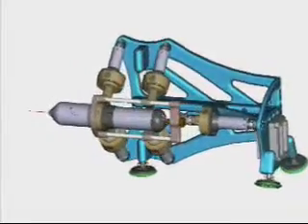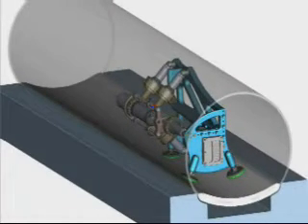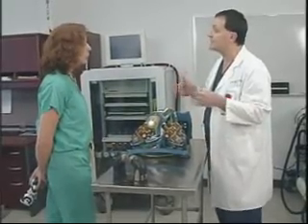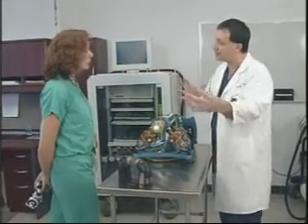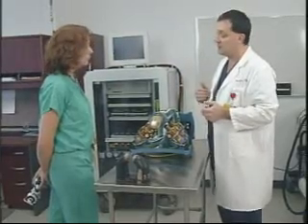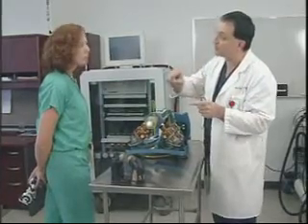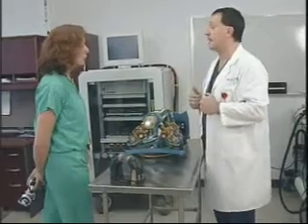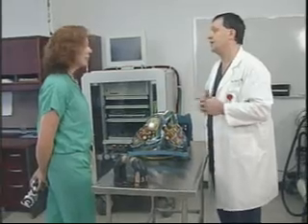Exactly. The robot goes together with the patient inside the MRI scanner. You acquire the images, and then you can control the robot based on the images, not under direct vision, but based on that 3D reconstructed space of the patient. In doing so, you can place a needle very precisely at the point that you select in the MRI image. So you can take precise needle biopsies, or you can deliver therapy at that location, needle therapies.